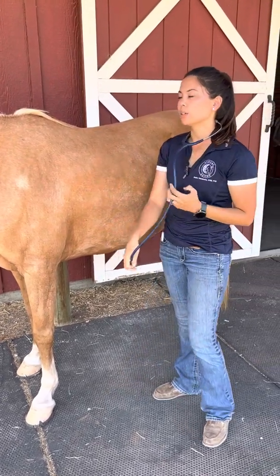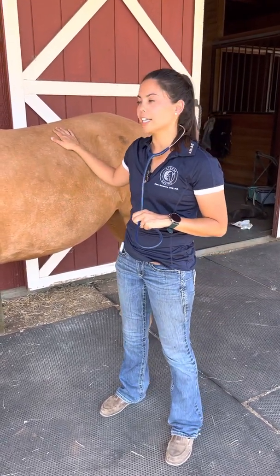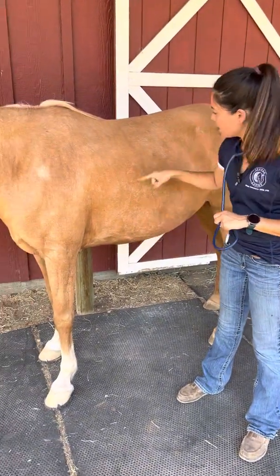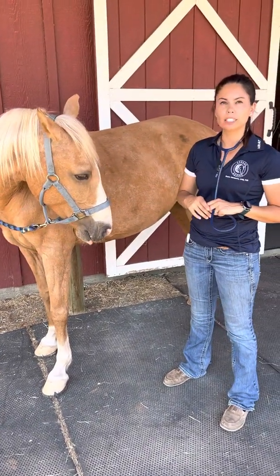The next important thing in horses, which you don't always do with dogs and cats because it's not as critical, is listen for their gut sounds. So when I think about their guts, I like to split them in half this way, and then I split them in half this way. So this is my upper quadrant and my lower quadrant, and it's like that on both sides.